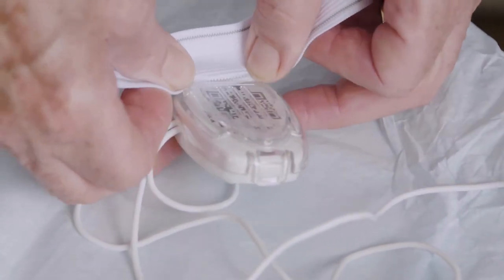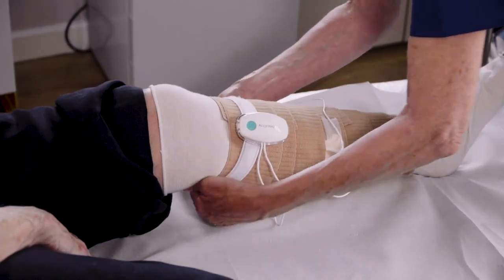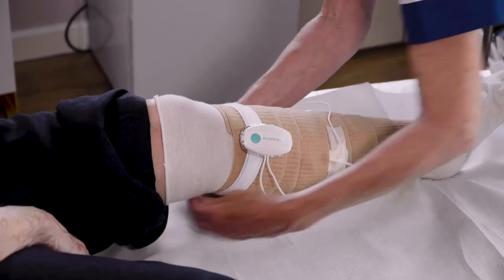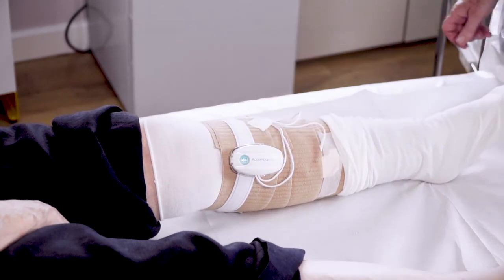Secure the device using the provided removable clip and strap, ensuring it is placed away from bony prominences, such as the tibial crest. Secure any free wires with tape.